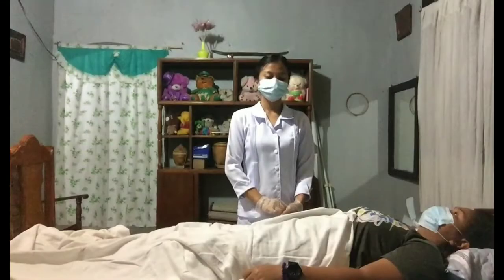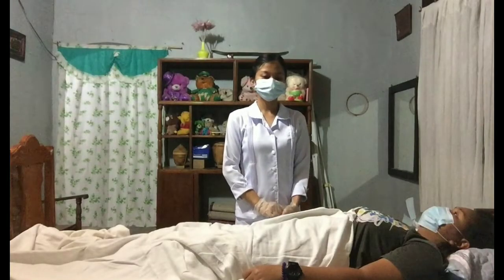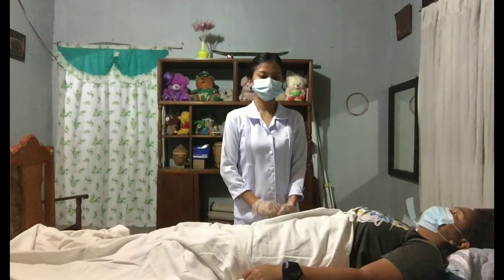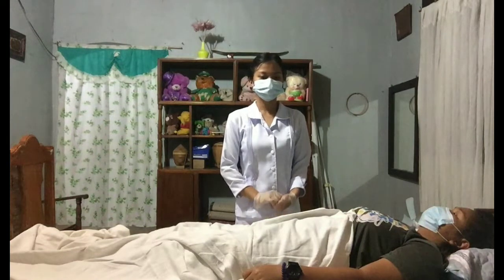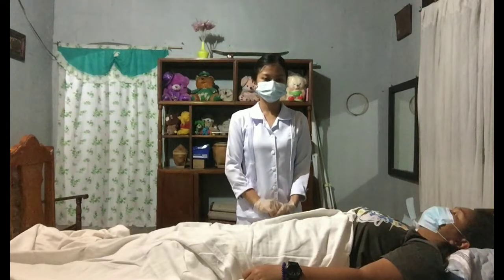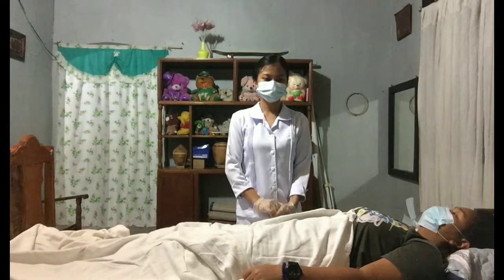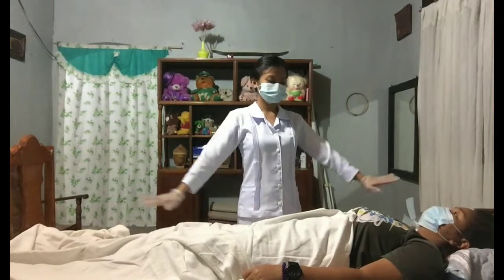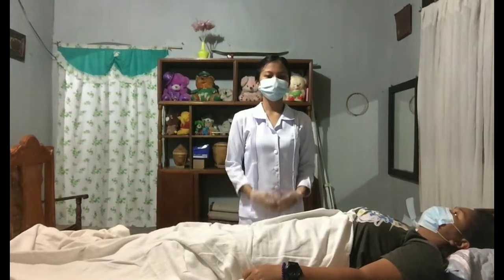The first step in assisting the client to a sitting position in bed is to adjust the bed to an appropriate and comfortable working height and place the client flat on the bed, or as low as the client can tolerate, with arms at the side and palms facing downwards.